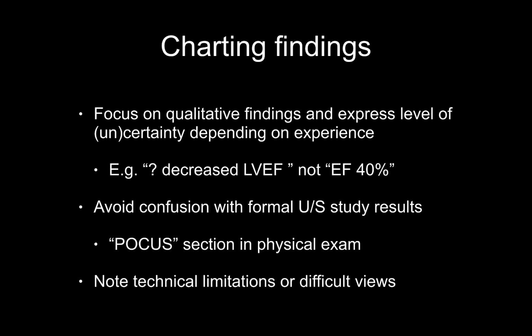and would not be appropriate at our level. Another thing to keep in mind is to express one's level of certainty in the findings and any technical limitations. So if you're unsure what you saw or if the views were difficult, don't hesitate to chart it. The radiologists and the echocardiographers do it all the time.